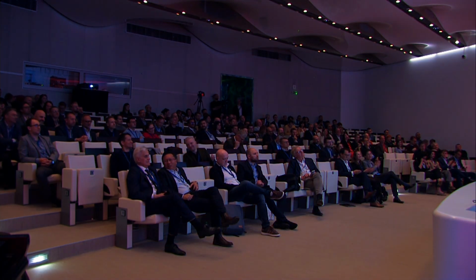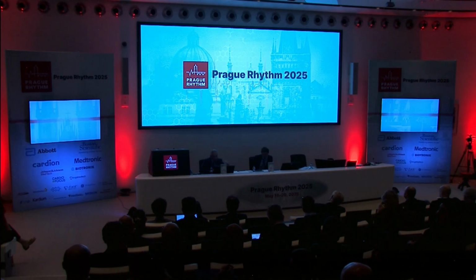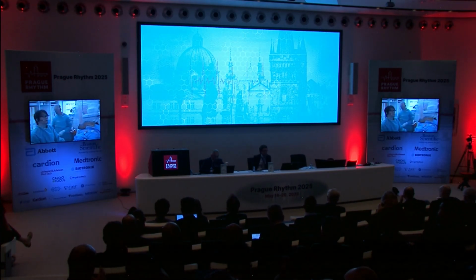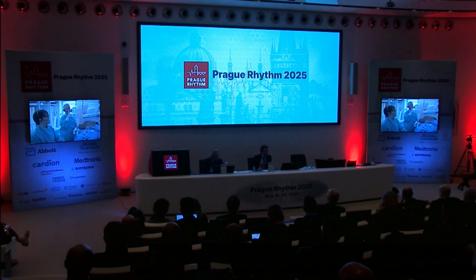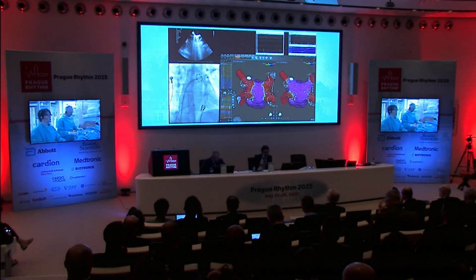No application. Catheter out. Okay. Can we move back to Homolka? We should have a report or update of the previous case, and we should have a pre-recorded presentation. Perfect. Okay, so Peppo, can you hear us? Okay, we are back, right?